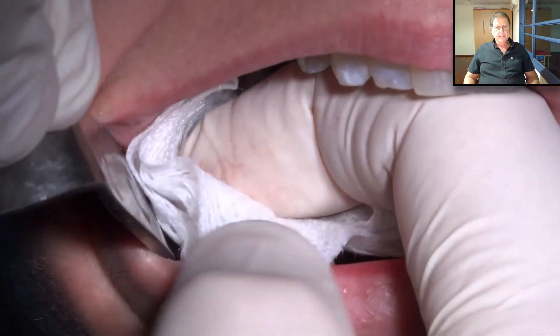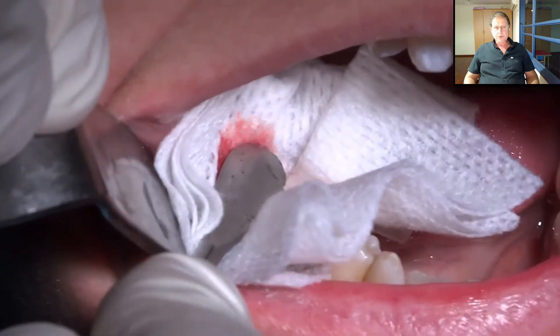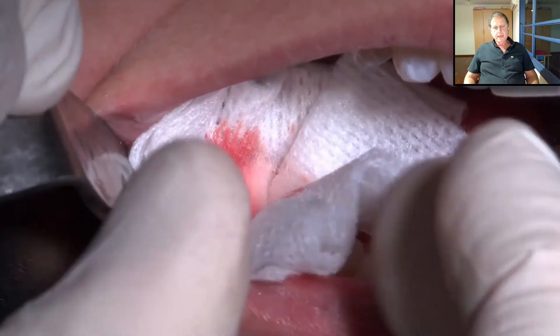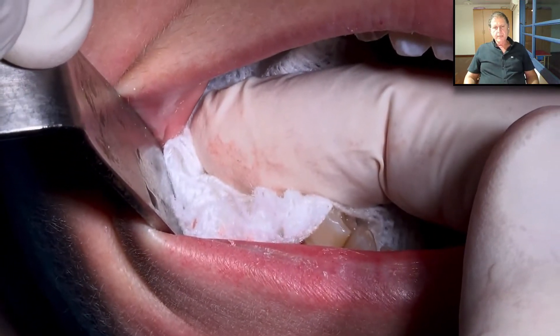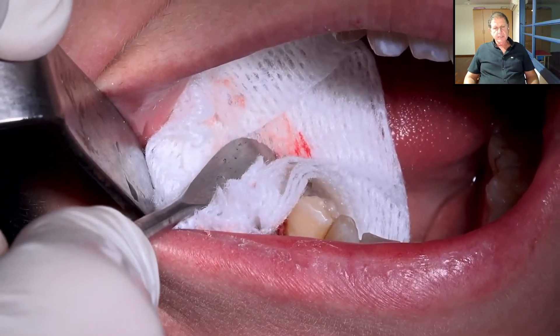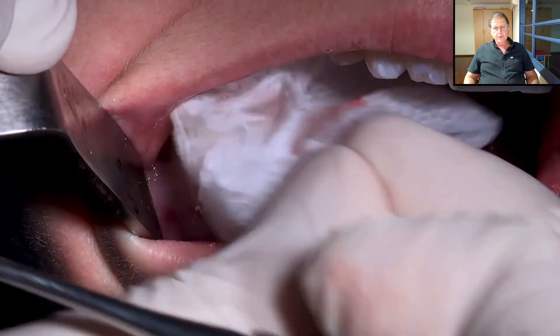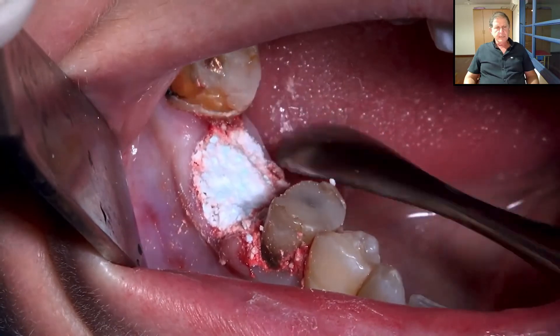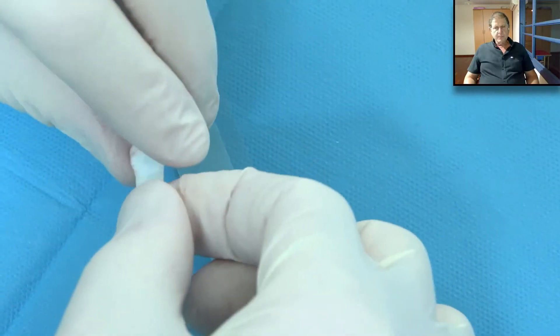We eject it into the site, take a dry gauze, and press strongly with a finger — it's very important to press strongly. Then immediately we add additional compaction with a periosteal elevator, each time about three seconds, not more. We add a little more, press again, and add additional compaction. Material that will not be compacted will not give you the same result. Now we remove the excess. Before placing the Oraid, we clean the area with a dry gauze and then with a moistened gauze.